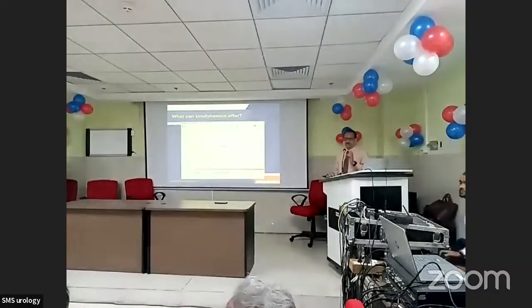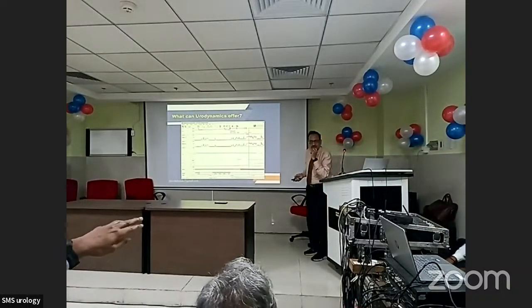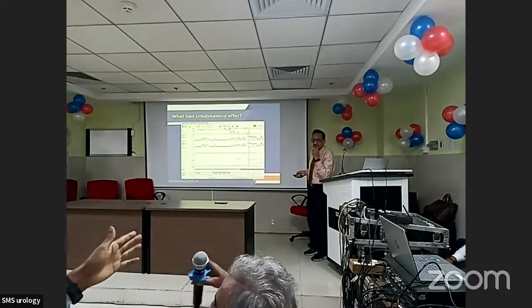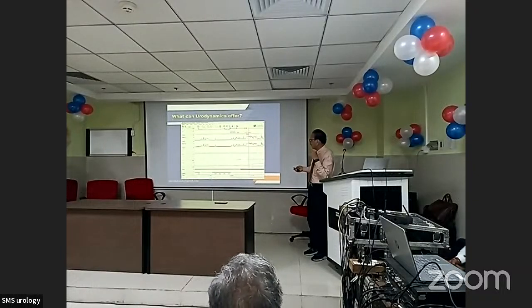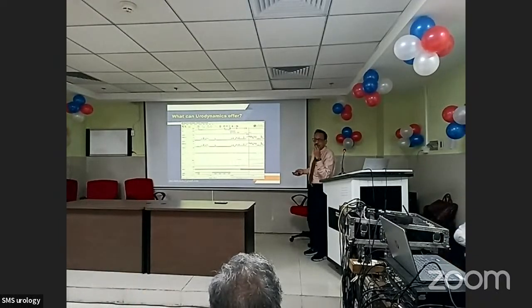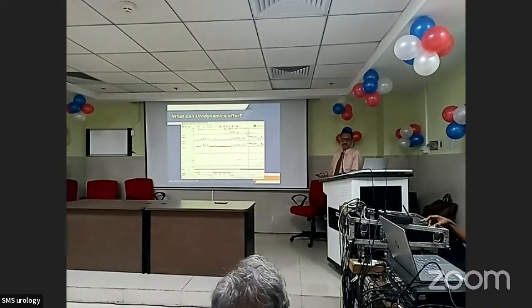One question. She has got a rise in intravesical pressure, and at the same time EMG activities are there. I'm talking about abdominal pressure. There is a rise in abdominal pressure with this straining, and at the same time EMG activity is also high. So probably she might be trying to squeeze her abdominal muscles and gluteal muscles to prevent leak. That might be the possibility.